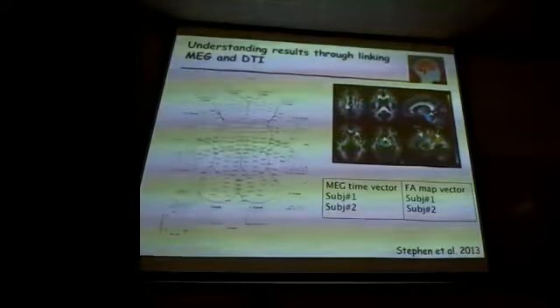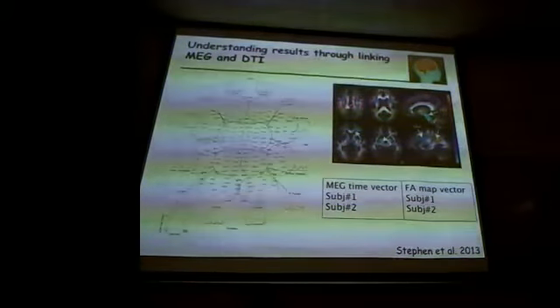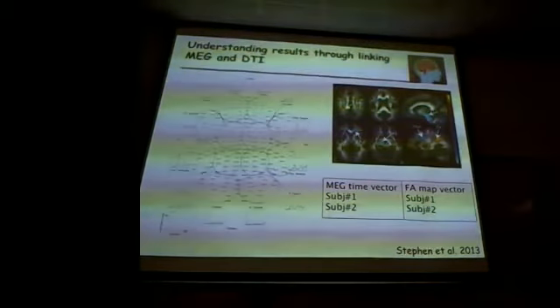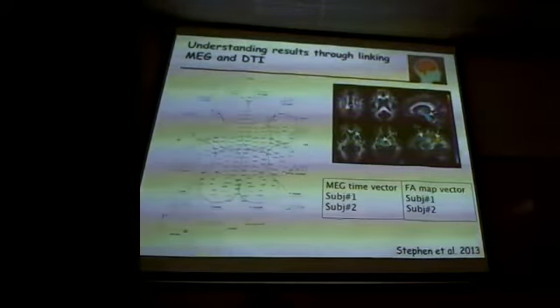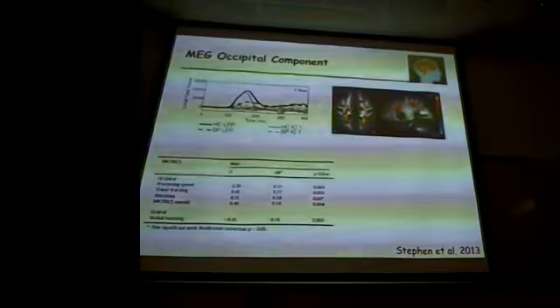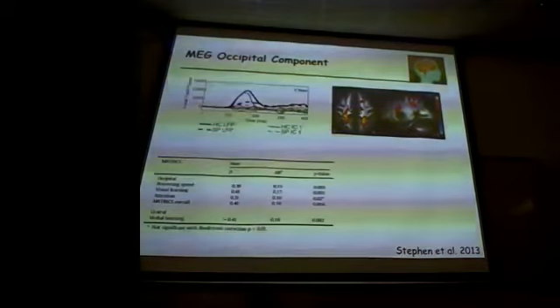For the MEG, we were just looking at regional analysis, so we didn't include all 306 sensors or even the source level, because there's a lot of data here already. So we transformed the MEG data into one long time vector, and so this is essentially doing time versus space. But we did find these associations that showed significant differences by group. And this is just one of the examples, which I still think is incredibly striking.